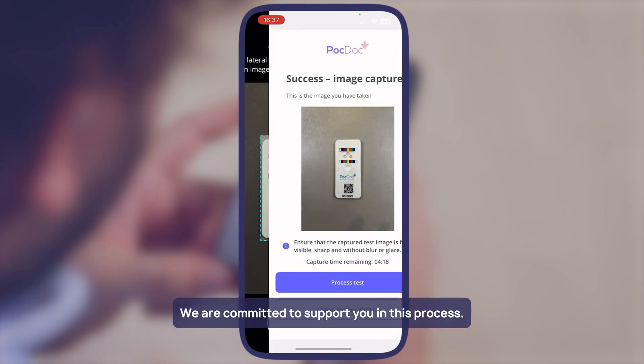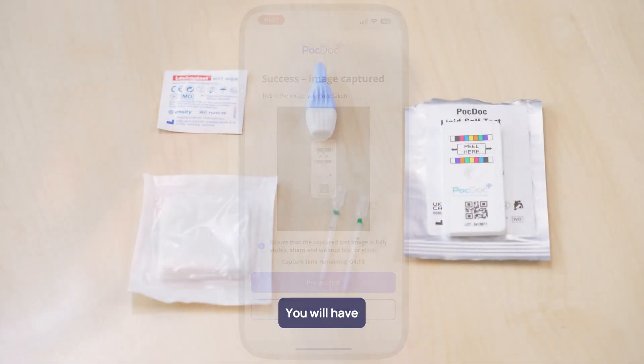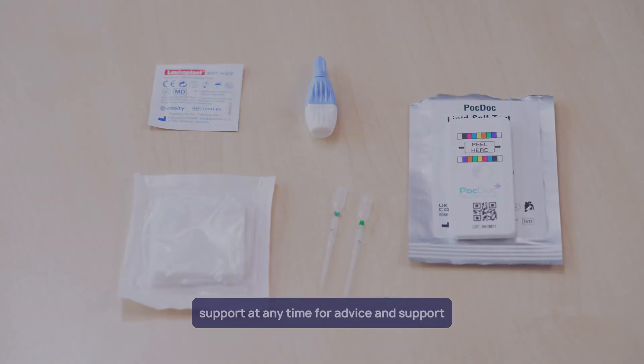We are committed to support you in this process, so don't worry if something goes wrong — you will have the opportunity to order a free replacement kit. You can also contact PocDoc support at any time for advice and support.